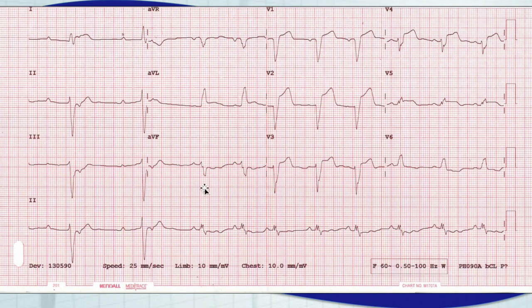All right, so I know I wasn't very systematic in interpreting this 12 lead. I just wanted to show you the many different changes. Now, that modified Sgarbossa criteria that I talked about from Dr. Steven Smith, and he's changed it a couple times to be more specific, but I like keeping it as wide a range as possible, and this kind of makes it easy. If you look at the amount of ST segment elevation, we're just talking about discordance, because concordance is the same rule. If you see concordant ST elevation or concordant depression, it meets Sgarbossa's criteria and it's a high likelihood of being an MI.